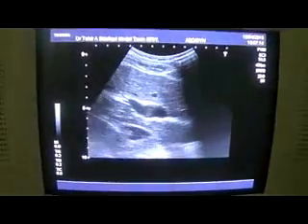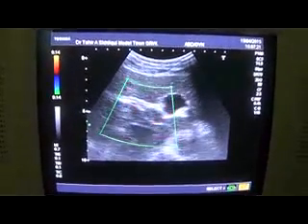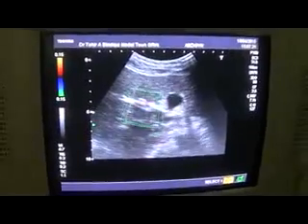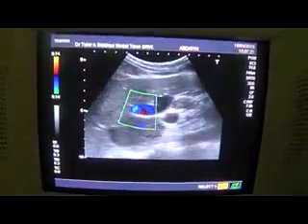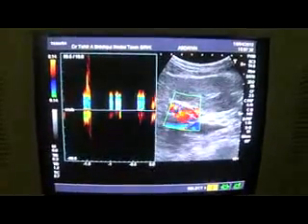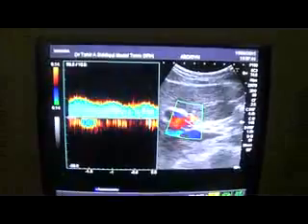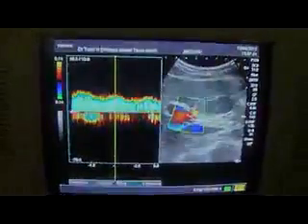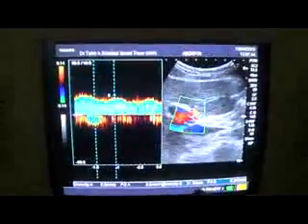Let's give another try. They say don't give up. Now let's try from the subcostal approach. If I just try to get the flow velocity of the portal vein, it comes to about 21.5 centimeters per second.